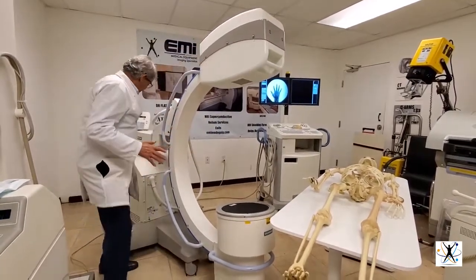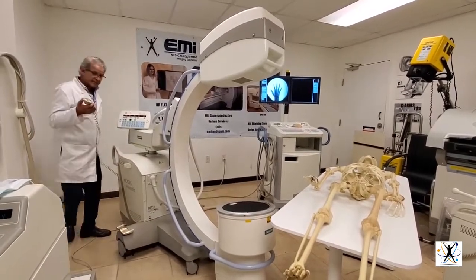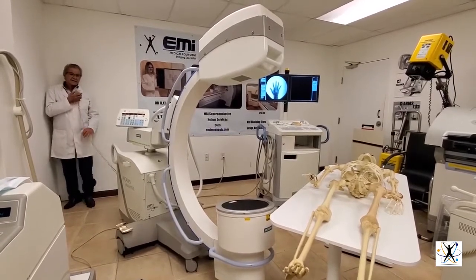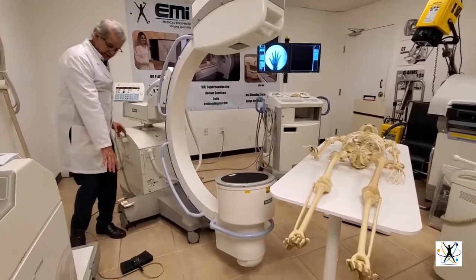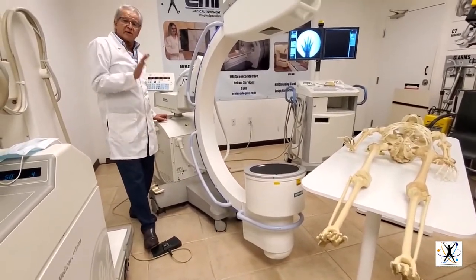You can shoot the X-rays with the control so you can get very far from the radiation and not get irradiated. The same applies with the foot pedal — it has a long cable so you can shoot from a long distance to avoid radiation.